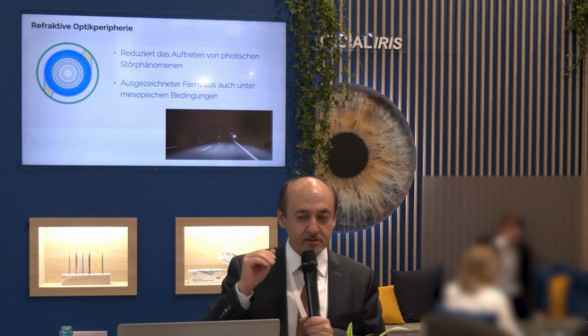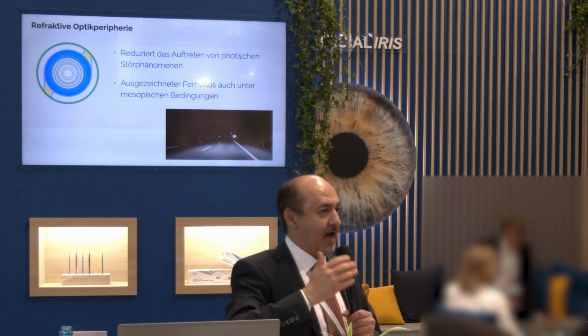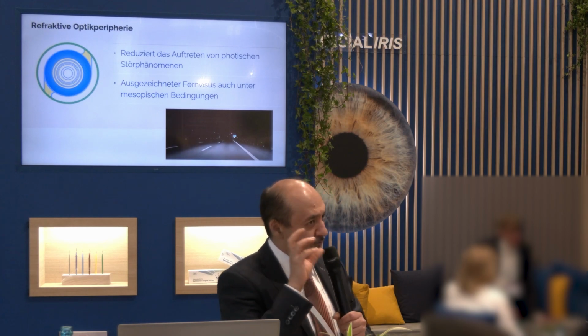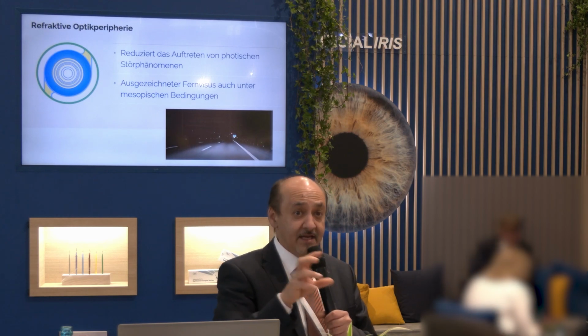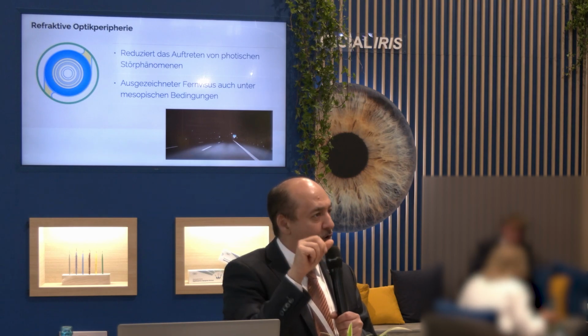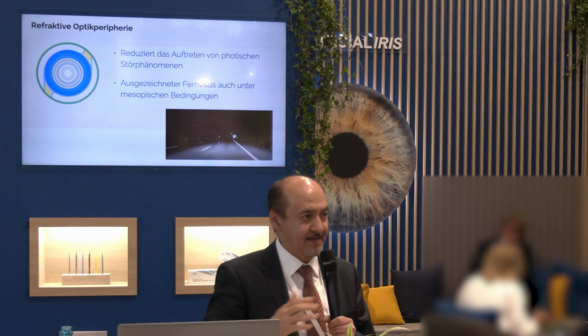Because the outer periphery is simply an aspherical monofocal optic, they have a really good light output in this area. In situations such as night driving, television, cinema, where distance plays a role, you don't really need the diffractive elements.